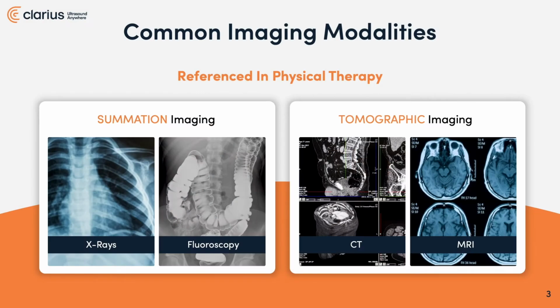There are two different categories of imaging modalities that are out there that I want to just briefly outline for you, and then get into how musculoskeletal imaging fits into this spectrum. First, summation imaging, and then we'll talk about tomographic imaging.